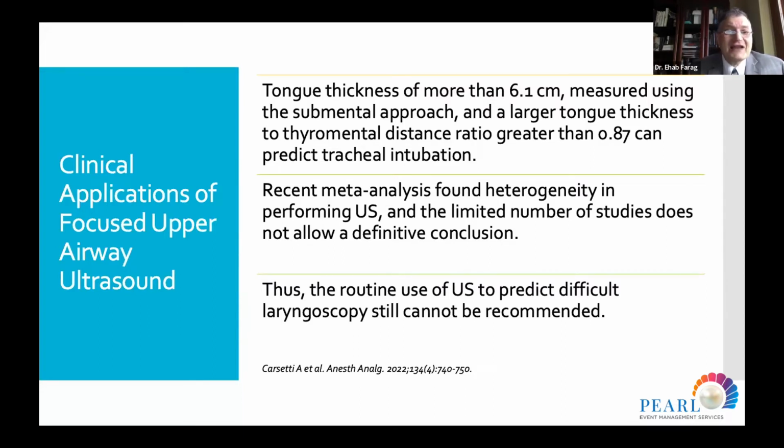All of us have the ultrasound, and you can use it as a tool in the OR or ICU setting. So use it, and it might be helpful for you to have suspicion of a difficult intubation. If it's not a difficult intubation, well and good. But if it is, you already have all the equipment available and can predict the difficult intubation, and you will be well prepared.